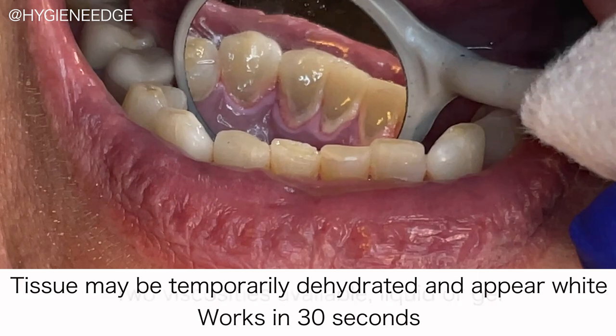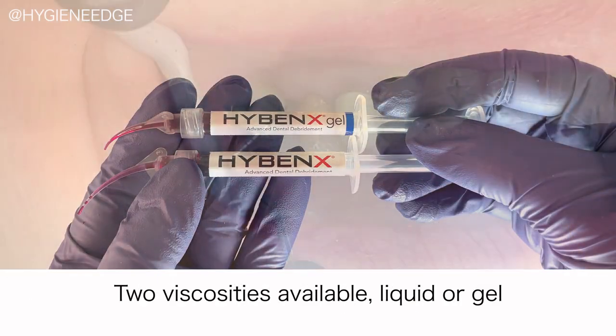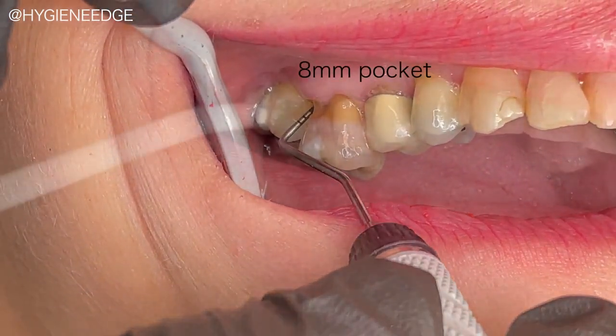For your handling preference, there are two viscosities available — a liquid or a gel. And Hybenx is really easy to use, so first, dry the treatment area as thoroughly as possible.